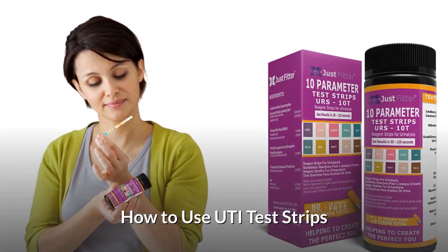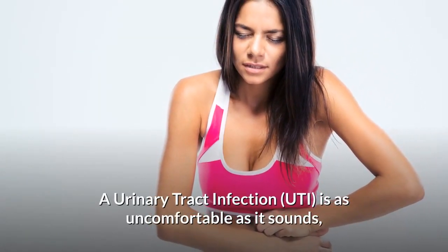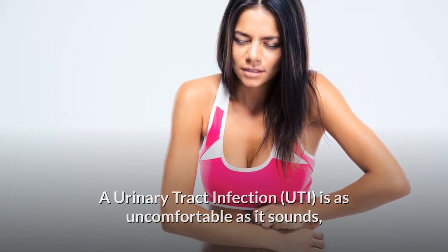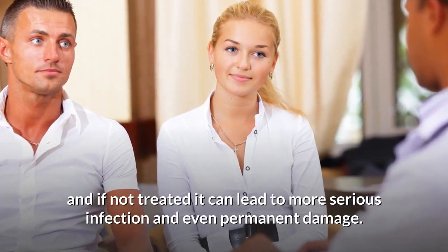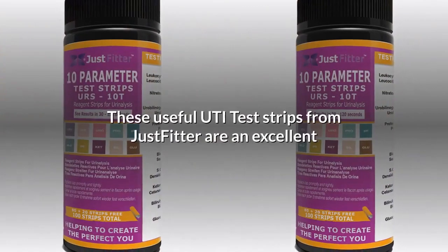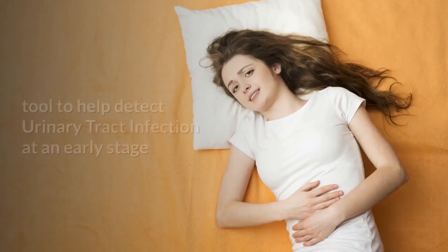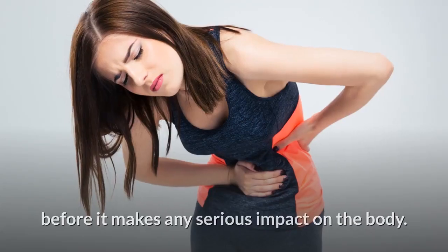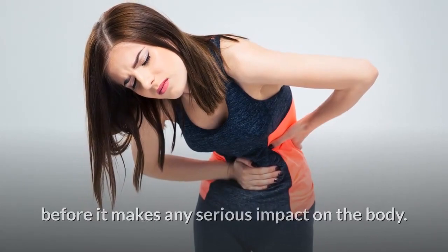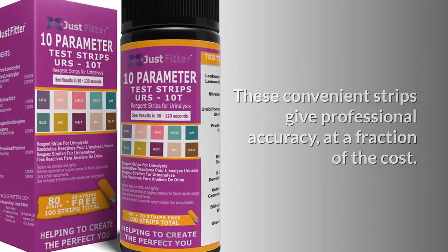How to use UTI test strips. A urinary tract infection is as uncomfortable as it sounds, and if not treated, it can lead to more serious infection and even permanent damage. These UTI test strips from JustFitter are an excellent tool to help detect urinary tract infection at an early stage before it makes any serious impact on the body. These convenient strips give professional accuracy at a fraction of the cost.